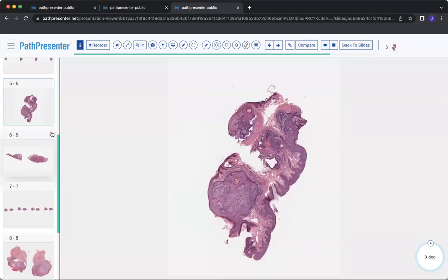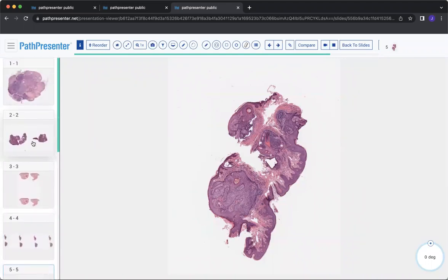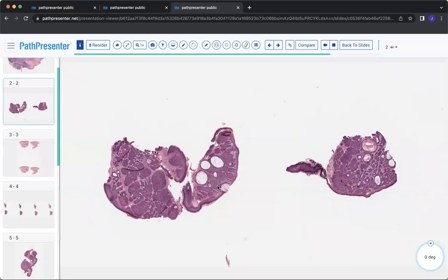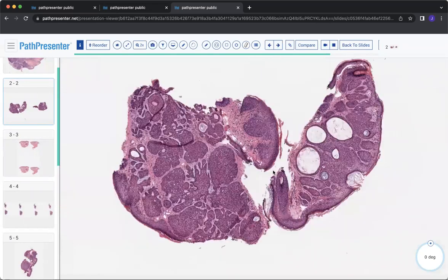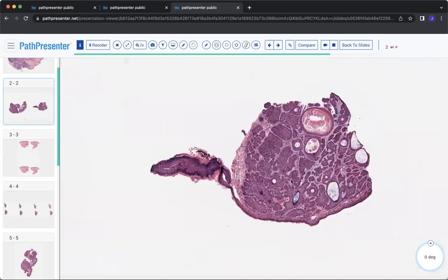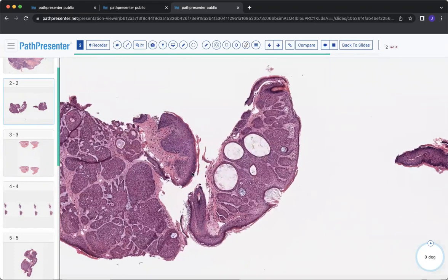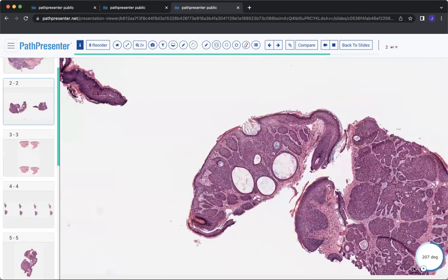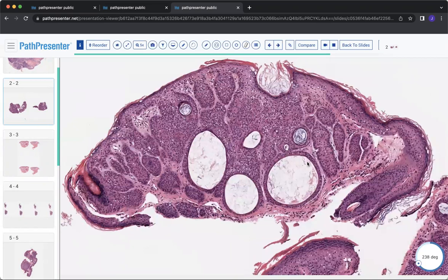Now, just to kind of back up a bit, because we're going to get into a discussion here. The trichoepithelioma that I mentioned to you earlier, you can often see basal cells in trichoepitheliomas, as well as spiradenomas, which we will not mention in this data set, and cylindromas in an entity called Brooke-Spiegler syndrome. So Brooke-Spiegler syndrome is a mutation in the CYLD gene. So if you got an entity like this and they asked you what genodermatosis you should be thinking about, you should be thinking about Brooke-Spiegler.